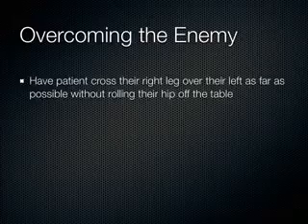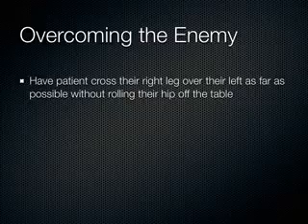So how do we overcome the enemy of bowel gas? Well, the first thing I do is I have the patient cross their right leg over their left leg, and we'll do this today with the models. On my earlier demonstration, I forgot to do that, but I think it's important to do that, to put the right leg over the left leg as far as possible without the patient falling off the table.